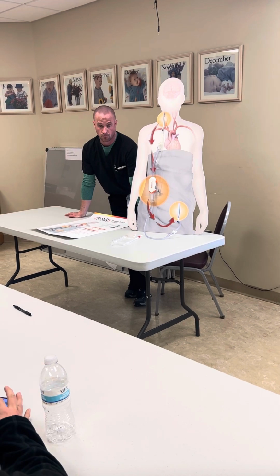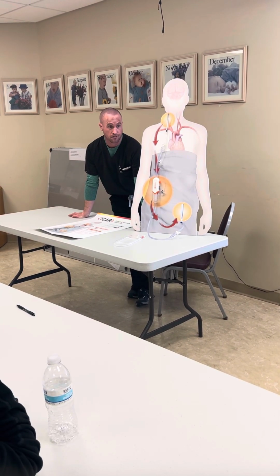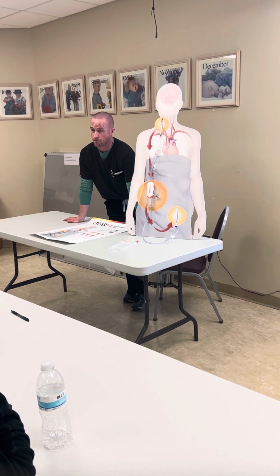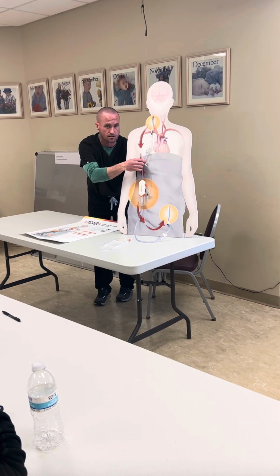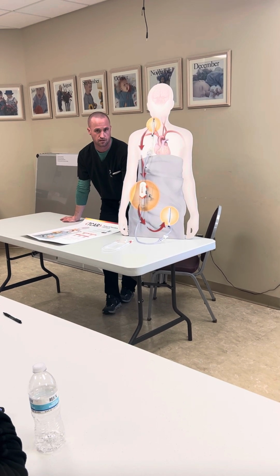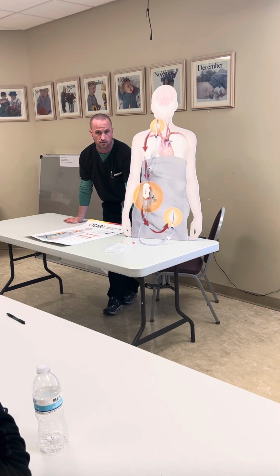And again, I just left Fort Sanders and we've done 300 over there, and I still stand back there at the back table and walk them through prep from time to time. Believe it or not, there's a series of stopcocks, so sometimes that can throw people off. They're like, crap, it's not holding, it's not flushing right or whatever. Again, we're here to help. That's what we're here to do.